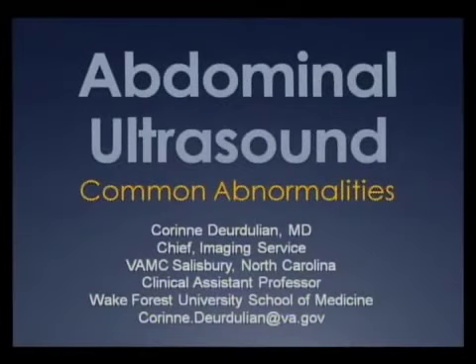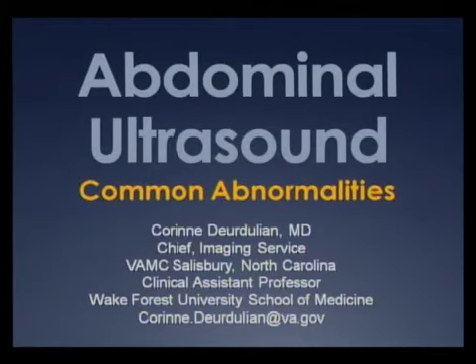Good afternoon, everybody. Today I'll be talking about common abnormalities in the abdomen, and there is considerably more detail in your syllabus, so today we'll be focusing on the images predominantly.